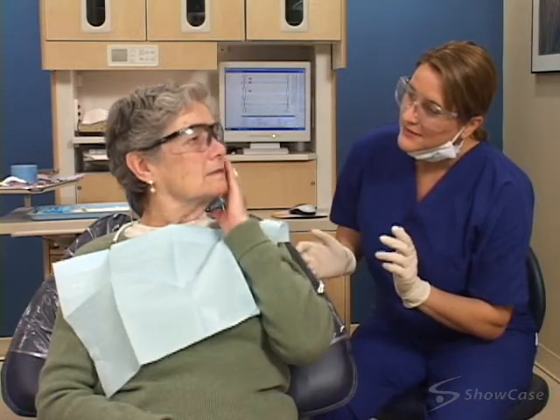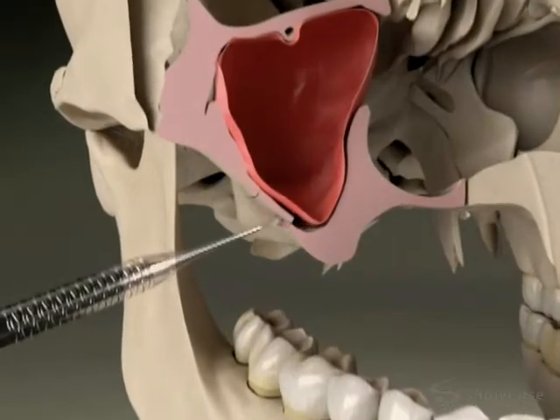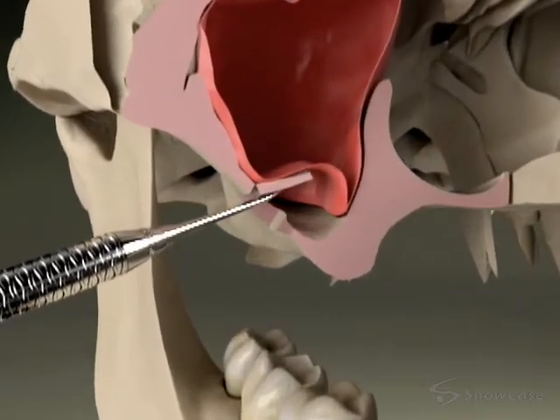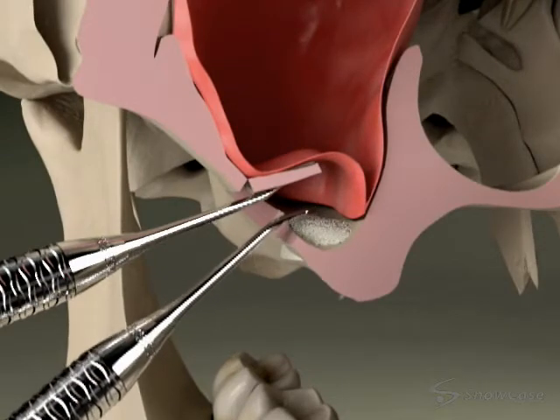We make sure the area is thoroughly numb. In a sinus graft, we open a small window into the sinus area above the missing tooth, and then place bone grafting material on the floor of the sinus.